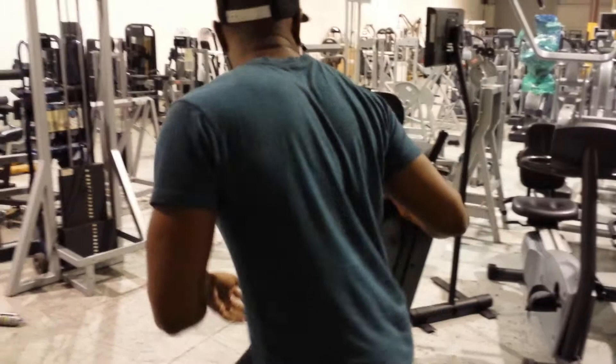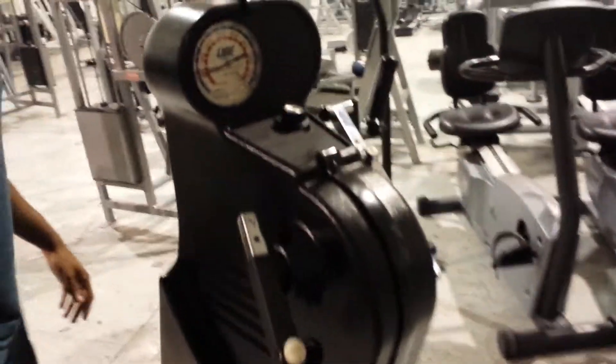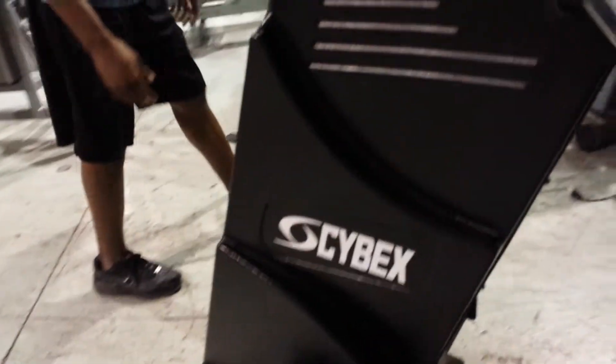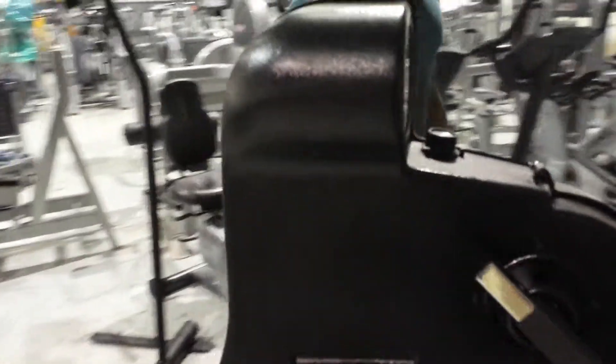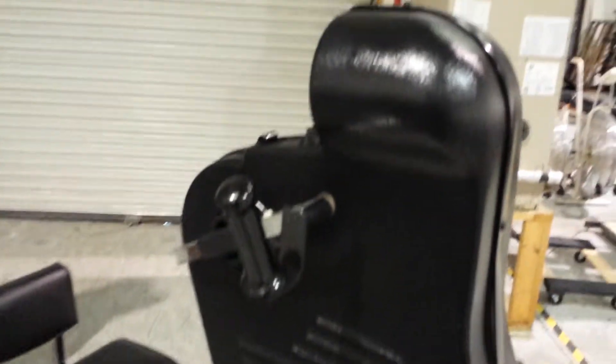This model has been fully refurbished. It's got a shiny black finish. We have four of these to choose from.